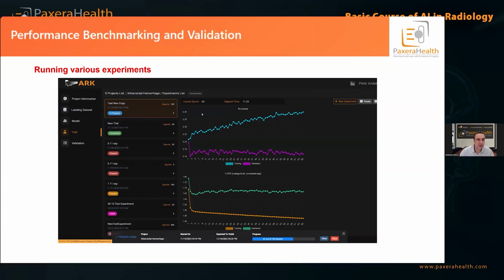Now, we're still testing, so it's almost 40%. So the algorithm is not functioning well. Maybe I need more epochs, I need to change the data, I need to apply maybe a different model. And then I will also see the validation. So the training and validation are not fitting together, which is another problem. We talked about it yesterday, overfitting, underfitting and the best fit.